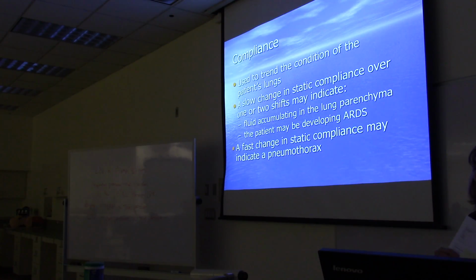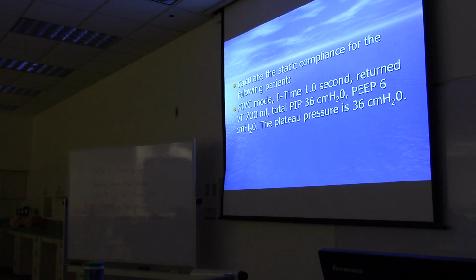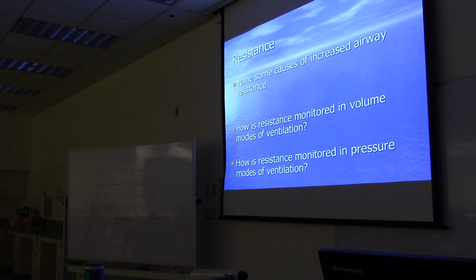If you have a fast change in your static compliance, that indicates a possible pneumothorax. Calculate static compliance. You guys have done this, so I'll skip past it.